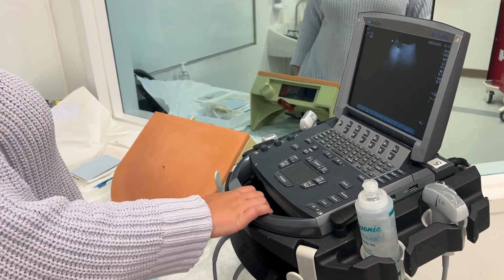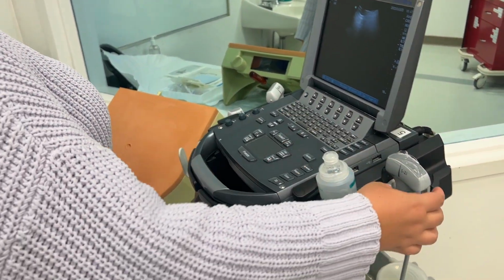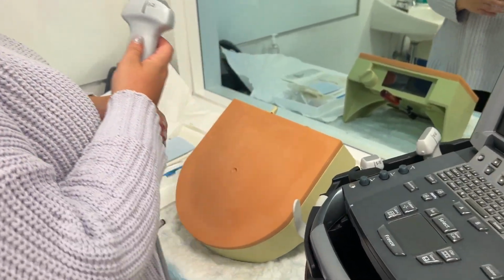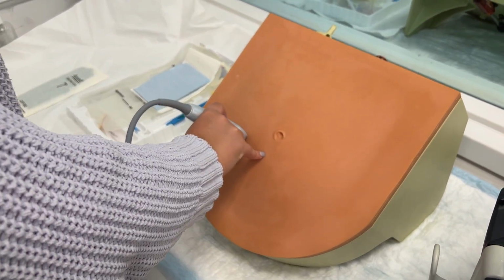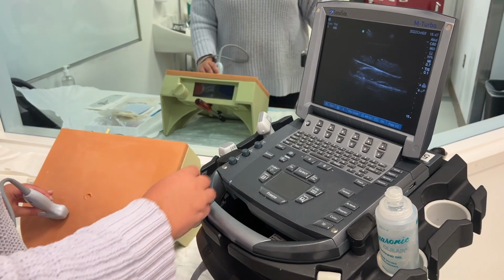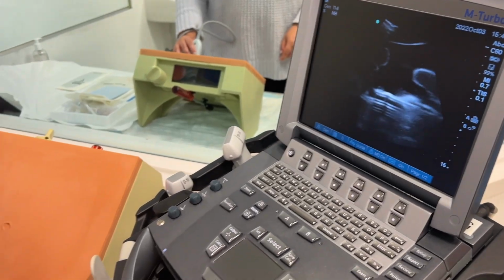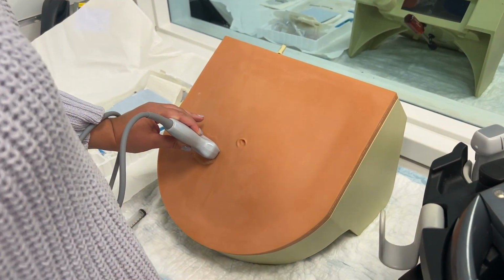We'll start by grabbing the ultrasound to help us identify a pocket of ascitic fluid to drain. First, grab the curvilinear or abdominal probe. Most providers like to start by looking in the lower quadrants, most commonly the right lower quadrant. Here you can try to identify an anechoic area of fluid. That way you can avoid omentum and bowel during the procedure.